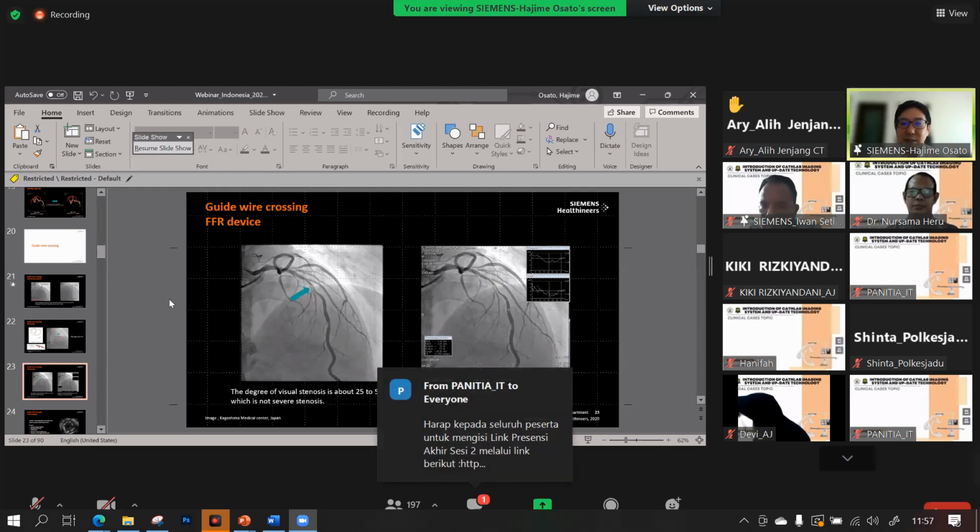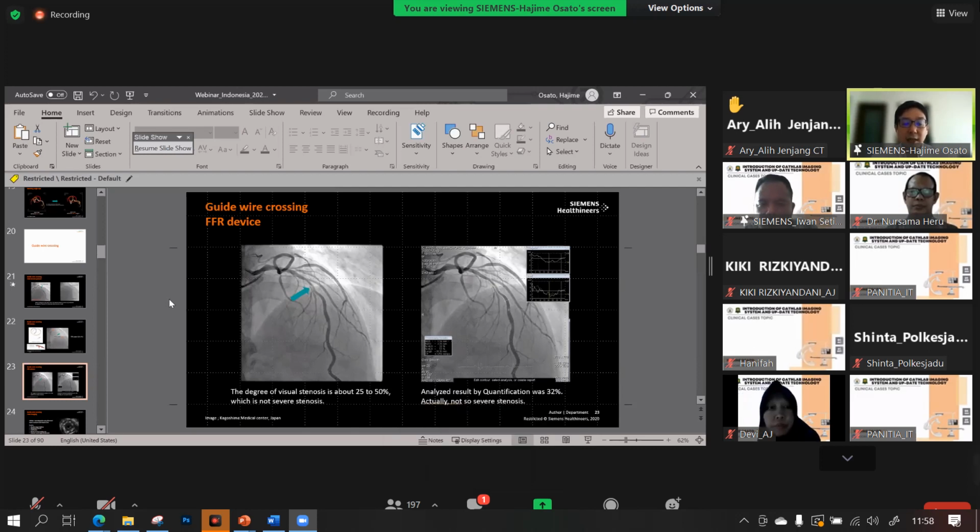But I don't have any data on the difference between the systolic and diastolic phase, whether it makes a big difference for the stenosis rate or not. Actually, there is no rule. There is no recommendation of systolic or diastolic for the QCA. There is no answer. I'm sorry.